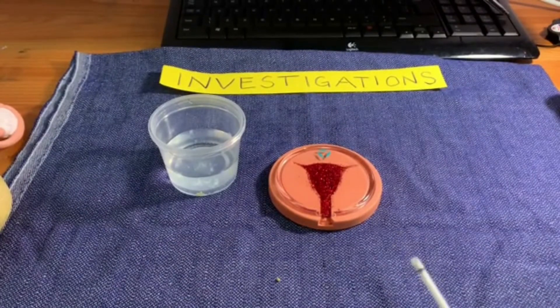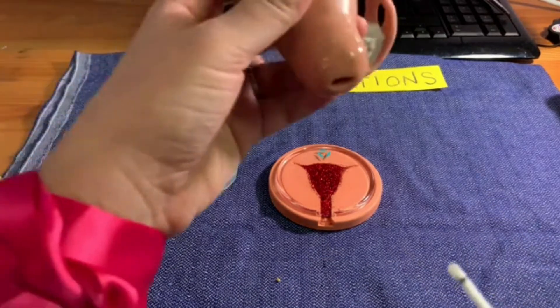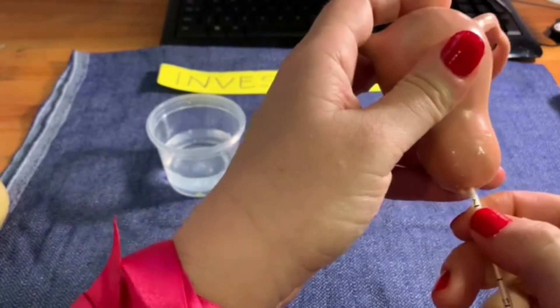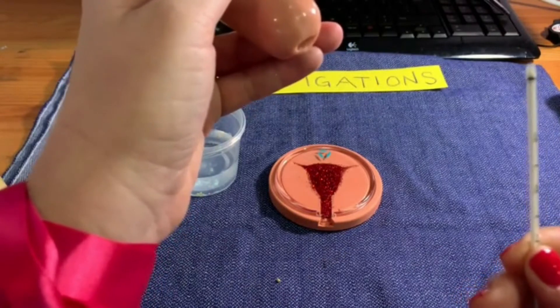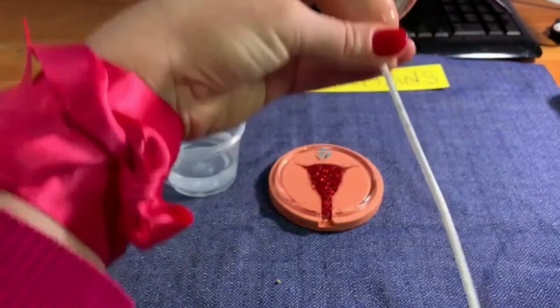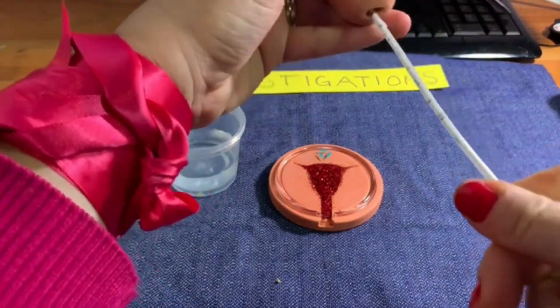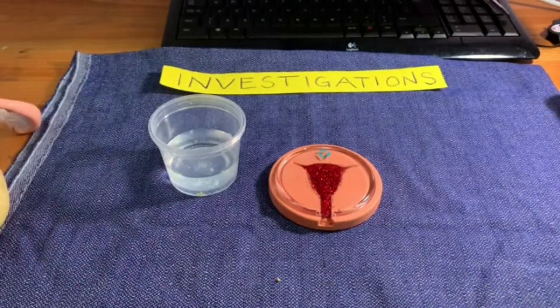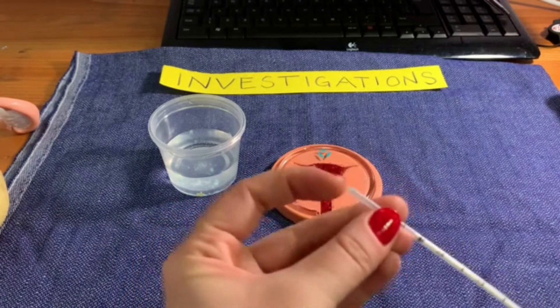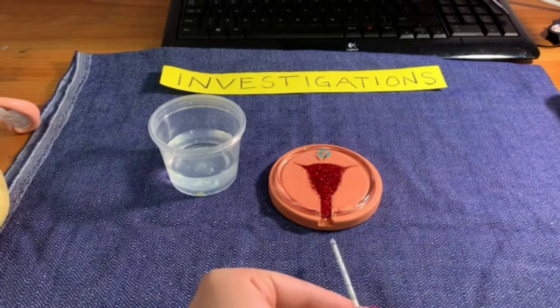You would use a pipelle — same setup as the pap smear or punch biopsy, speculum in, visualizing the cervix. You insert the pipelle right inside the uterus until you feel the fundus — about seven centimetres depth. You then pull out the inner part and scrape it around to get a sample of the endometrium. There is a small hole at the tip of the pipelle that forms a tiny curette, which you move around to scrape off endometrial tissue.